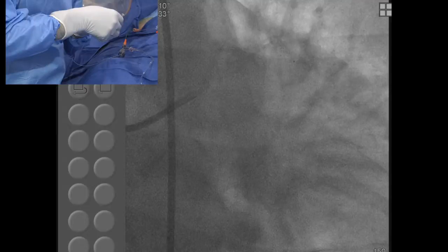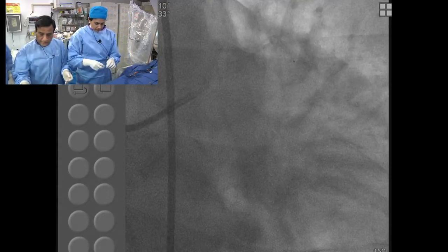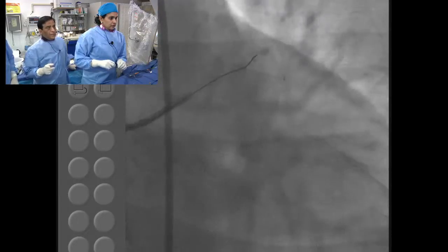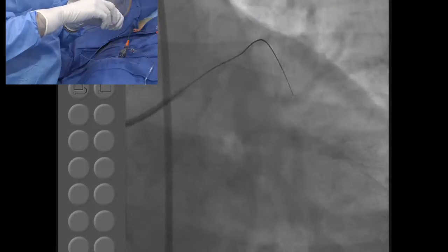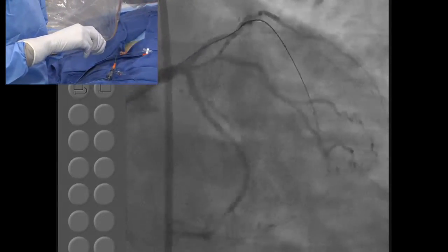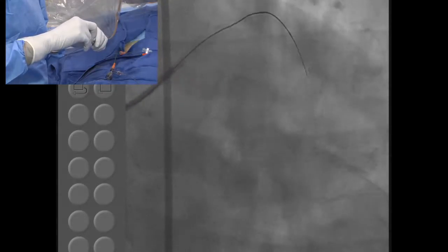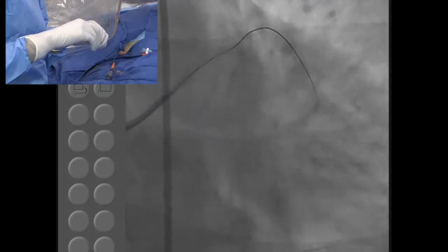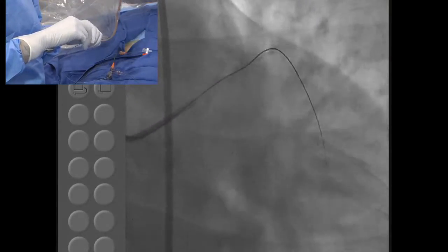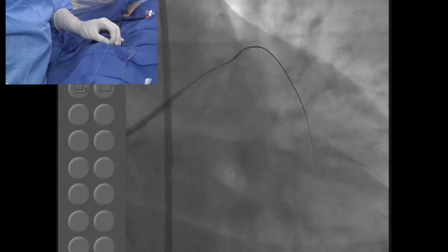So here is a question coming for you. Would IVUS help in any way? Actually, there is a very interesting IVUS CTO study, where they randomized the patients with IVUS after you cross with the wire. But yes, those who are very good at understanding IVUS in the CTO may find it helps to determine where to puncture, by putting in a parallel wire and bringing the IVUS catheter. But unless you are good at it, it is probably going to create additional confusion. So some people do believe in it, but IVUS for really crossing the CTO was at one point felt to be a very exciting venture, but has kind of fallen by the wayside. The challenge is the interpretation of the data you are acquiring. Exactly. You need to bring another wire, and that's where you need to leave the IVUS, because there is no forward-looking IVUS. It has to be side by side.